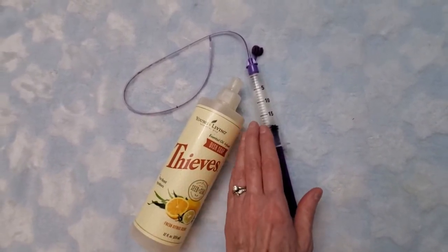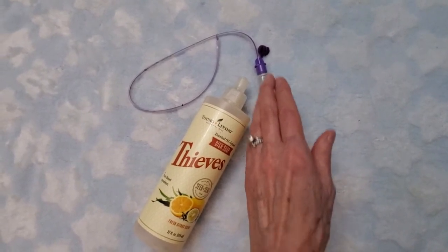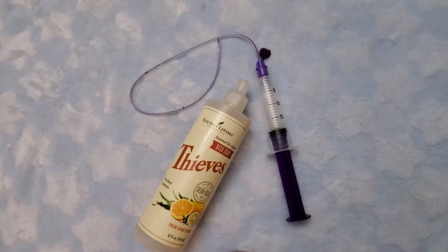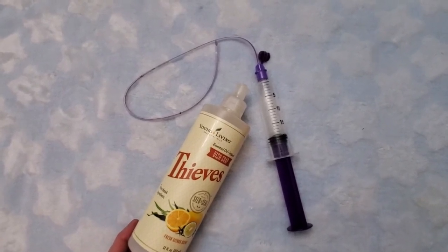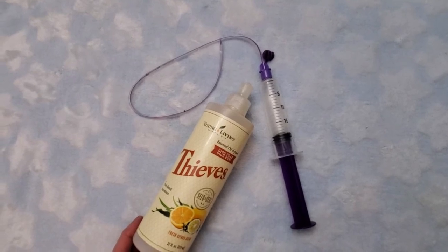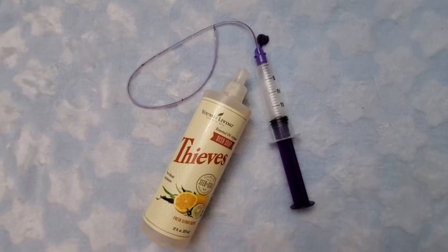I just use soapy water, fill this up, and shoot it through. Then I make sure it is as dry as I can get it, shake it out really good, rinse it really good, and let it air dry. So that's the pro tip from a natural rearing dog breeder.